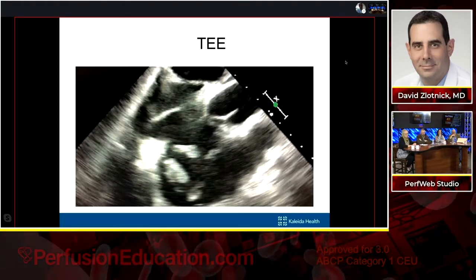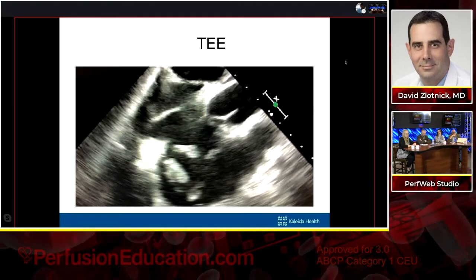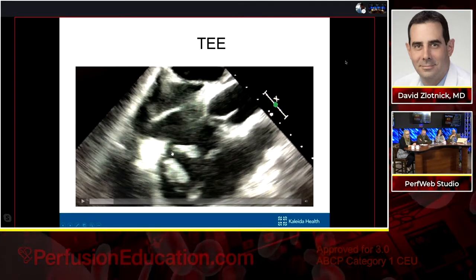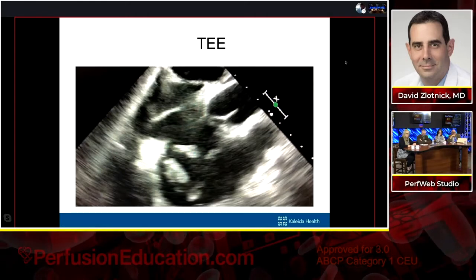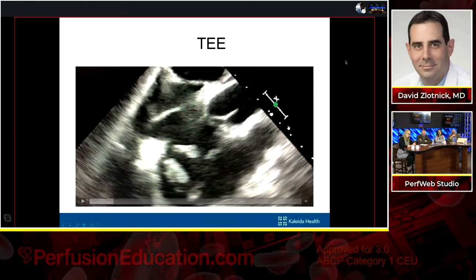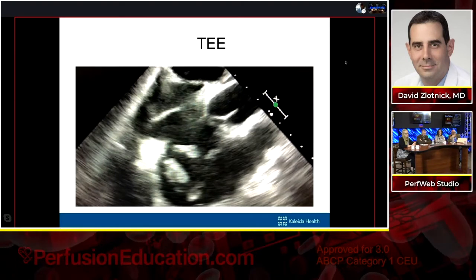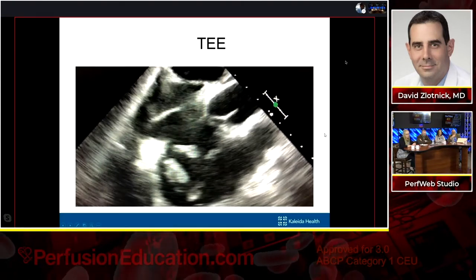All right. So it seems like every time I play a movie, we freeze for about 30 seconds. So I'll just wait till you guys come back. So there's multiple frond-like vegetations attached to the tricuspid valve. So this was really where we were going after. And I'll let the next movie play, but what it'll show is the AngioVac coming in from an IJ approach, so coming from the SVC into the right atrium, coming down on the tricuspid valve.